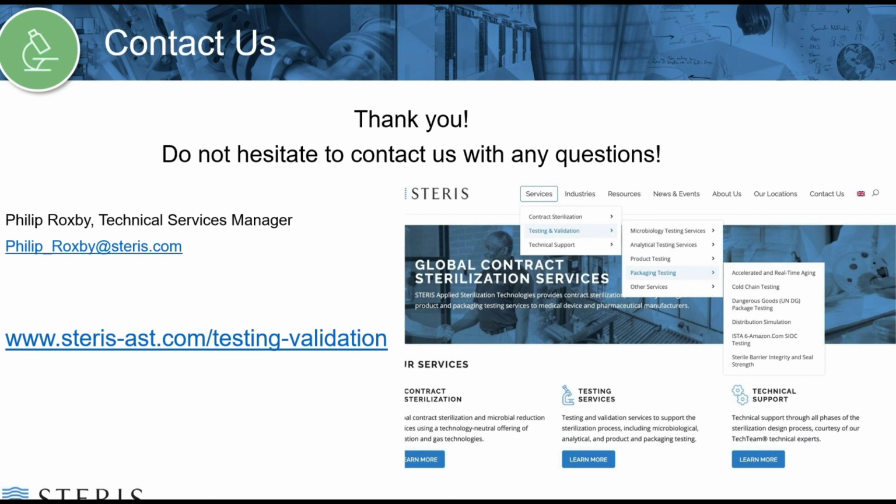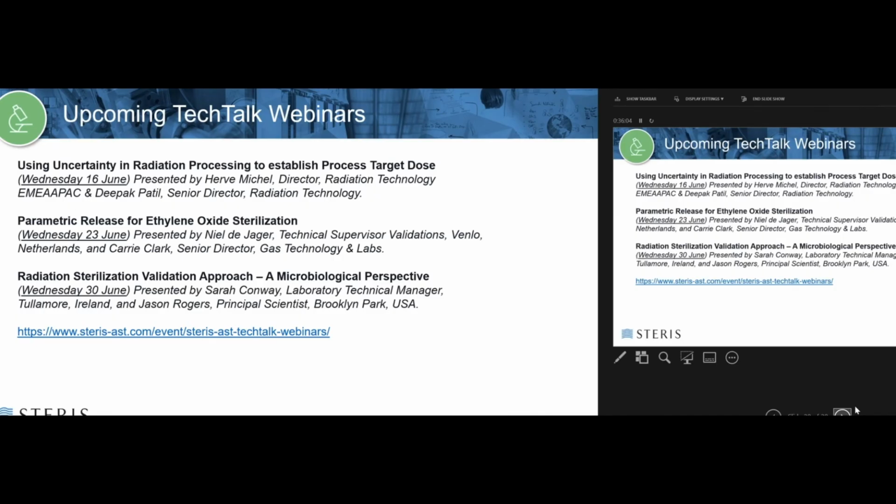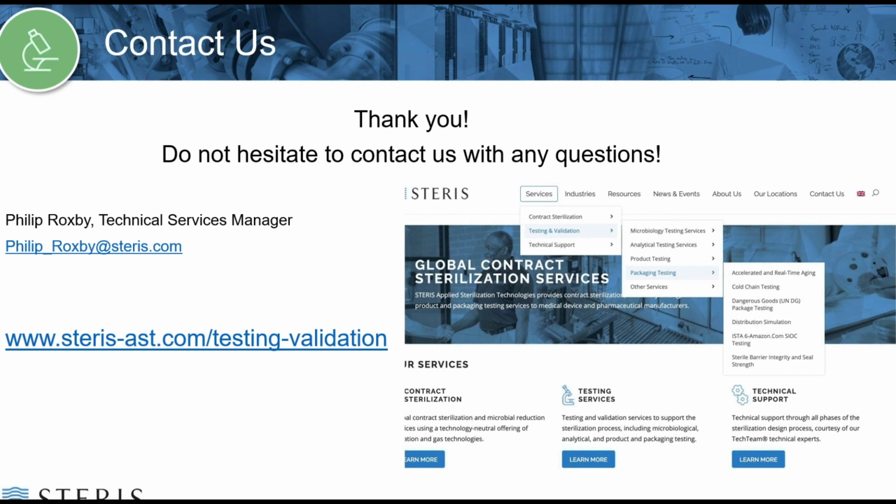And finally, I mentioned previously that edition 2 of ISO 80369 part 7 has been released. The most notable updates are revised torque values for the aforementioned resistance to separation from unscrewing test. There are now dimensional requirements for both rigid and semi-rigid materials, where before there was only one dimensional requirement. The specs for rigid connectors have tightened.